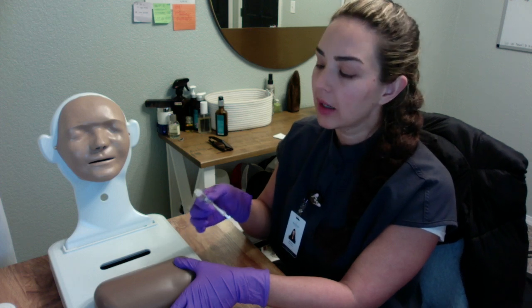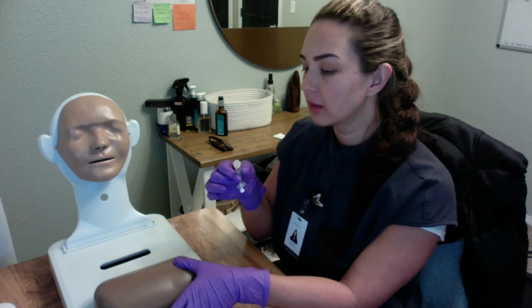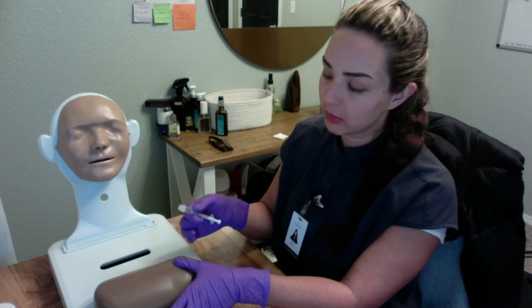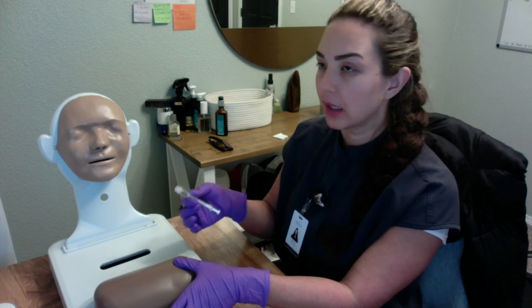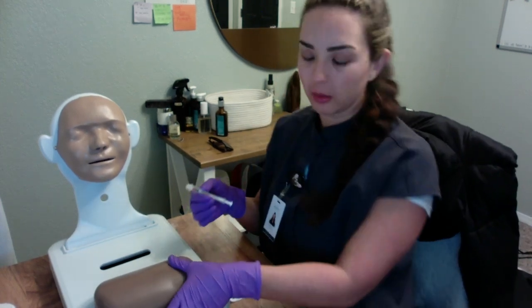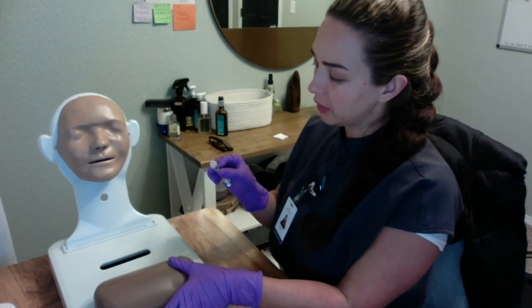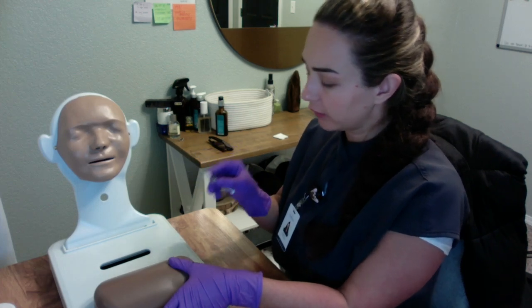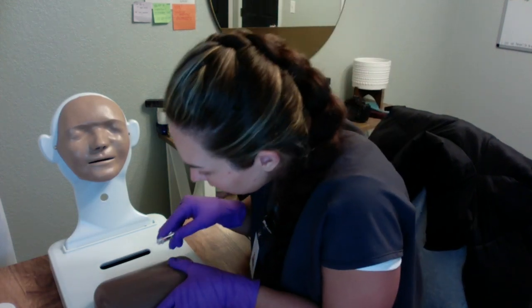When we are administering an intradermal medication, we want to make sure that it's a depth of 3 millimeters, but we're going to do it at a 5 to 15 degree angle. So I'm going to go ahead and pull the skin taut a little bit here, and we're going to, again, make sure that we're using the appropriate placement for fingers.